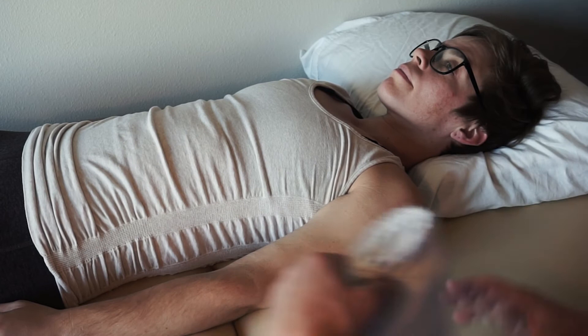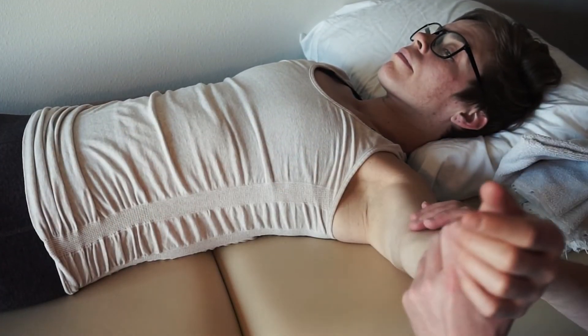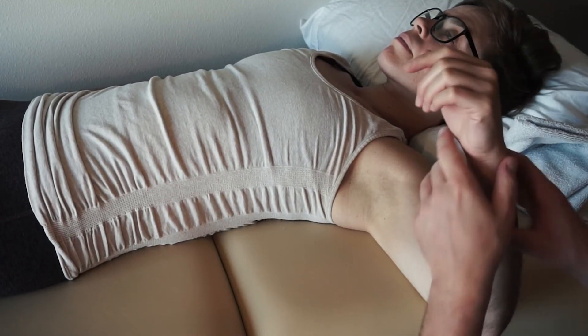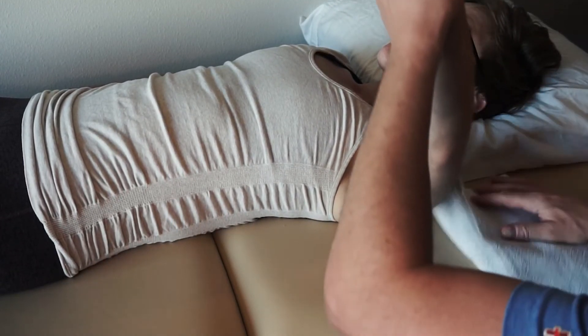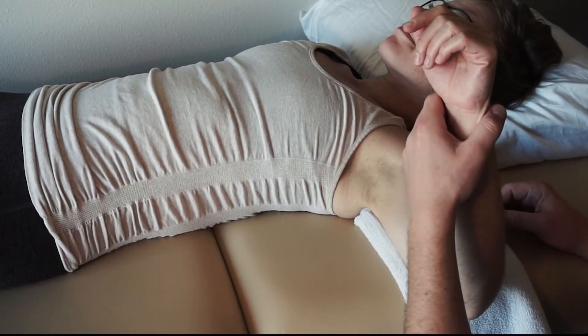Now in this position, we can do external rotation. You're going to abduct the arm to 90 degrees and try to get that humerus parallel to the ground. Let's just see — number one or number two? Number two. All right.